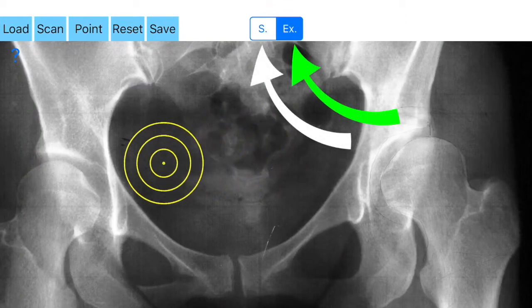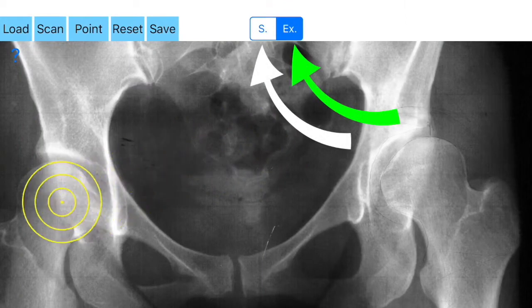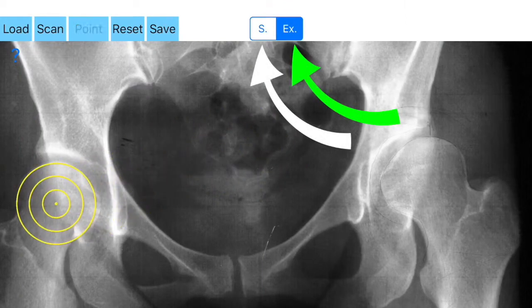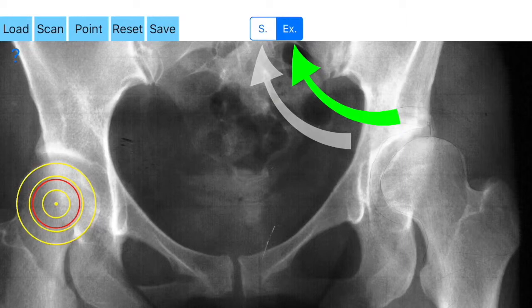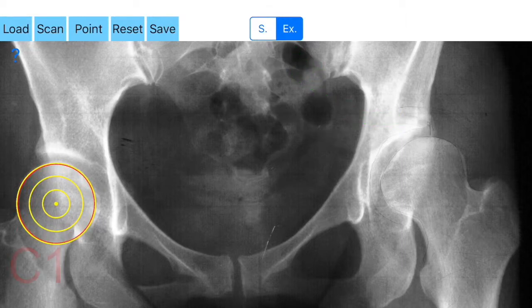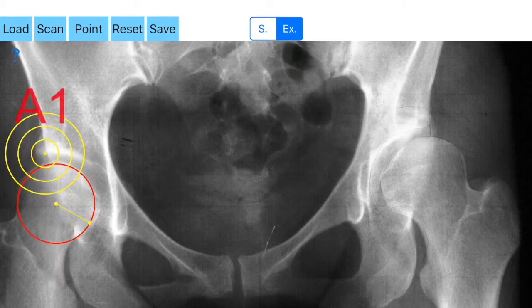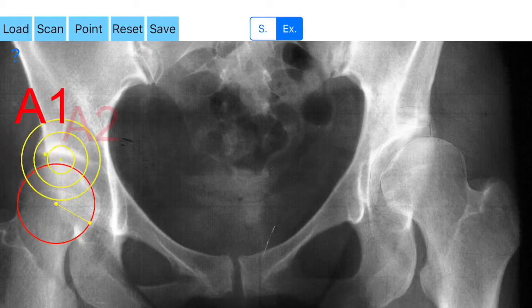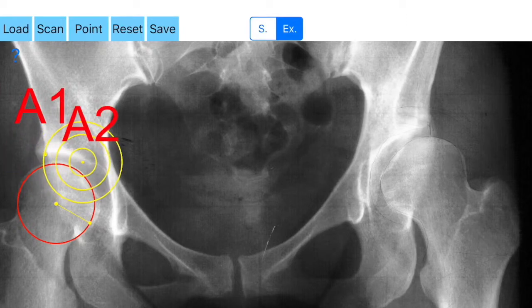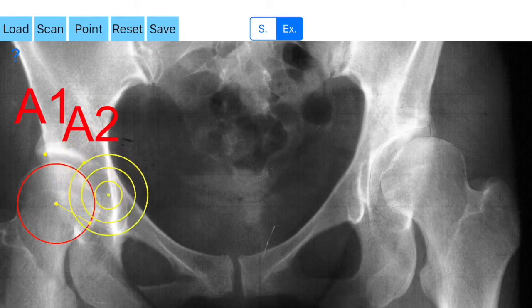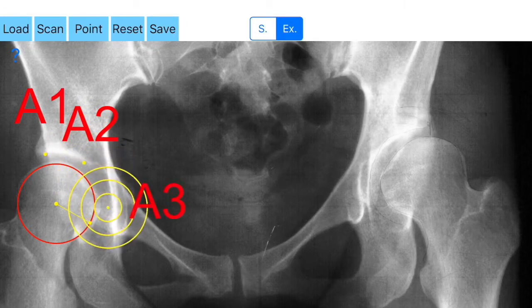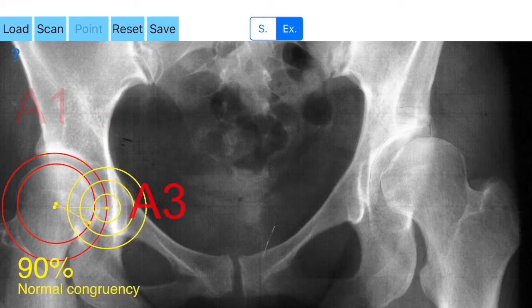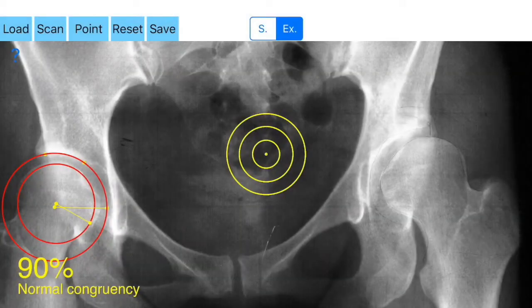If the button X is highlighted, you have chosen the extended method of measuring congruence. First, you aim towards the weight-bearing area of the acetabulum, namely the sclerotic roof, and by clicking the point button you mark three points one after another, following the imaginary best-fitted circumference of the acetabulum. By clicking the point button, A1, A2, and A3 are printed respectively.